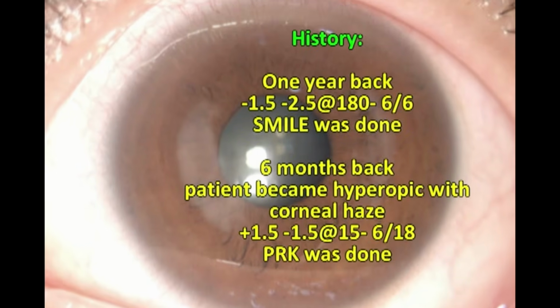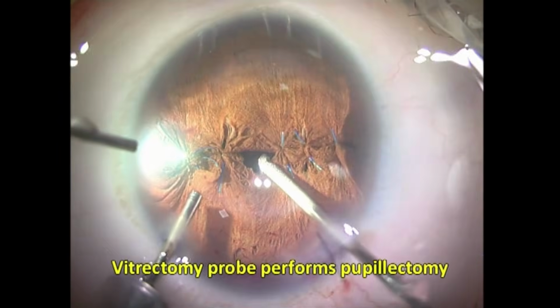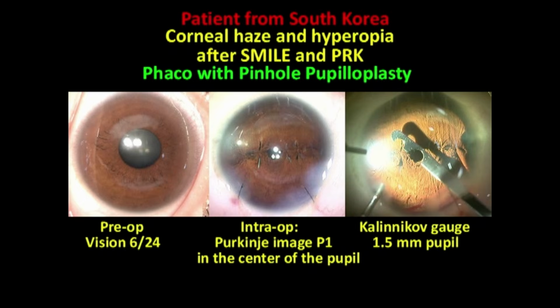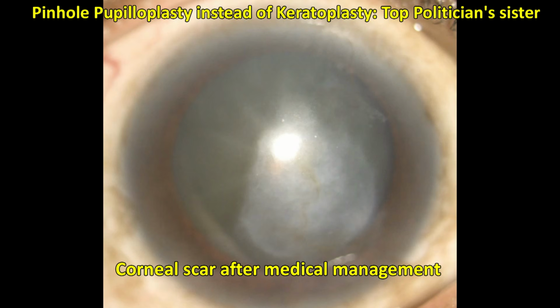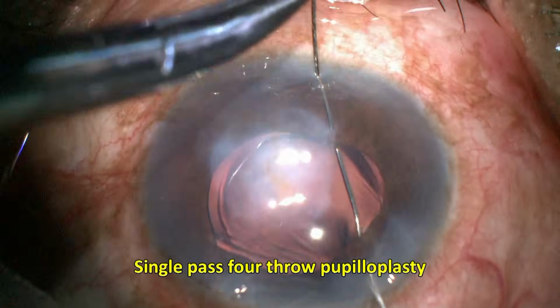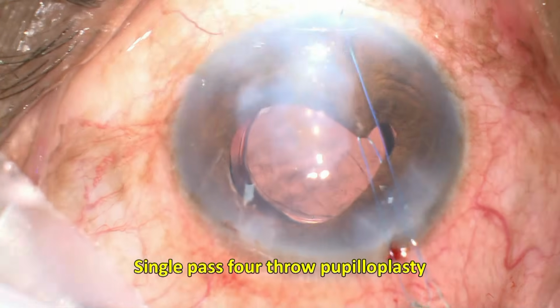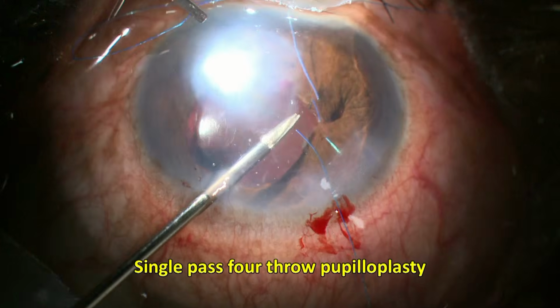Using a precise four-throw pupilloplasty technique, the pupil is constricted to a physiological pinhole of approximately 1.5 to 2 mm. This approach works well for paracentral scars. However, when the scar is central, a decentered pinhole pupilloplasty is performed, strategically relocating the functional pupil towards a clearer optical zone. When the scar is paracentral, the pinhole is centered on the visual axis. However, in cases of central corneal scarring, the pinhole may be intentionally decentered to utilize a clearer optical zone.